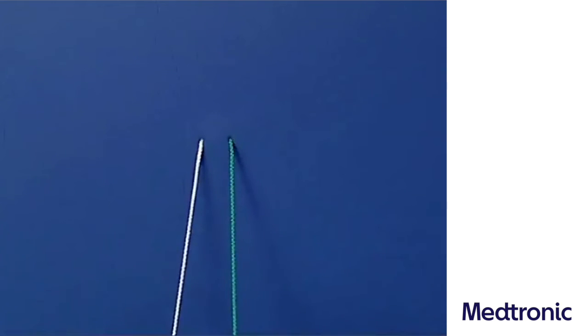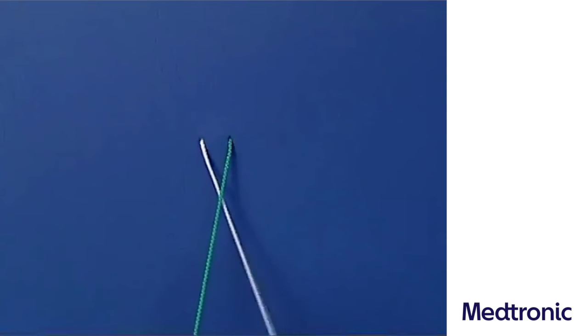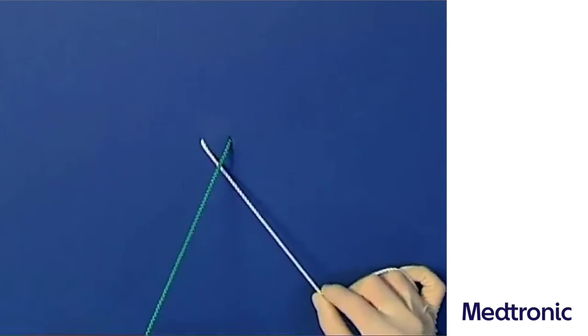The suture ends are again held crosswise. The tying thread, which is in the right hand, under-crosses the pulling thread.